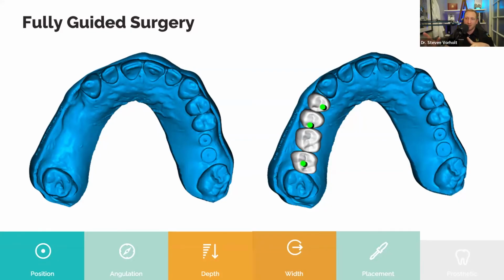That's really nice if you're doing something like bridges or you have pre-milled prosthetics, or you want to make sure that your timing is correct because you're going to do an angled abutment of some sort as well. And so in this case here, we have an edentulous span that's quite wide. It's 4 teeth. We're going to be placing 3 implants to replace those 4 teeth because posterior maxilla, very soft bone. We want to over-engineer this to a point.